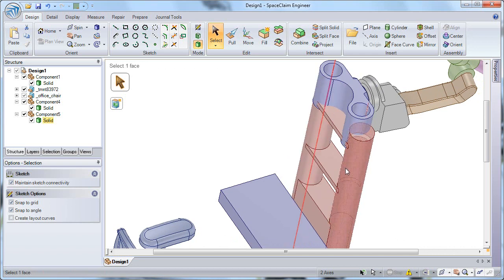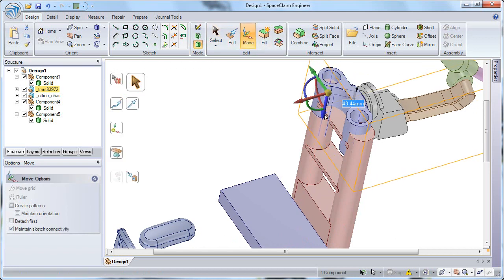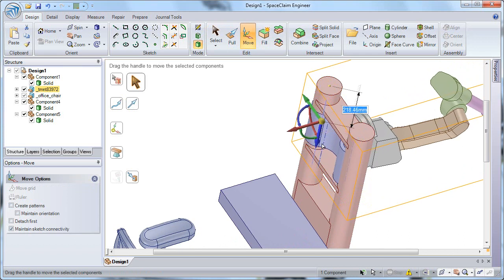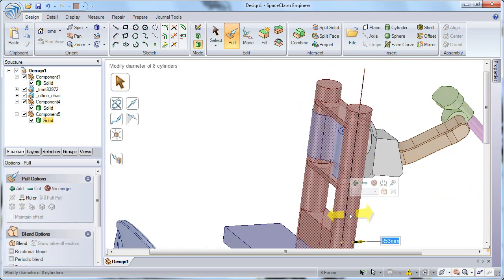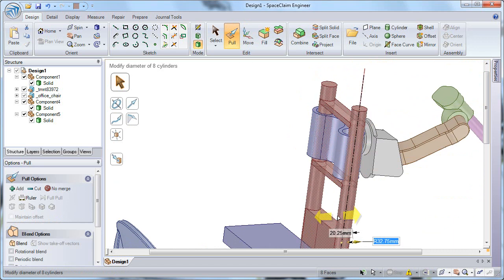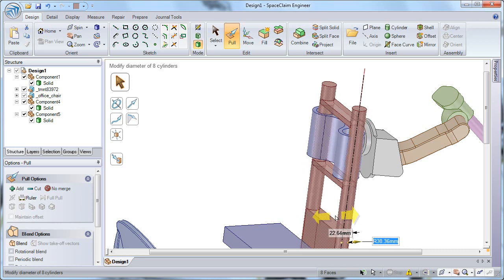Now you'll also notice that I need to make a few more adjustments to my mount before that'll fit correctly. So let's position our arm on the model first, and then we'll adjust our mount. So I can select on the arm in my structure tree, drag it along the blue arrow using the Move tool, and that's going to move that in place between my two support brackets. And now let's change the diameter of that mounting assembly. So I can change that manually, or use the Pull Up To command to make sure that it's the same diameter as the inside cylindrical wall of my arm.